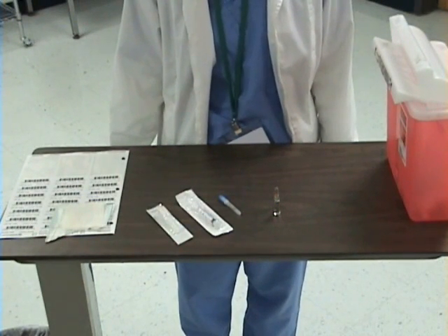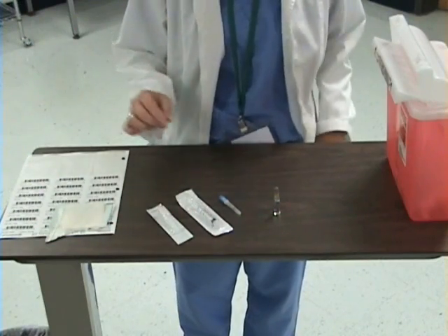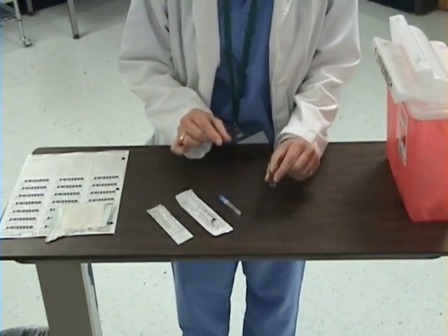This is a demonstration of how to withdraw medication from an ampoule. I will begin by gathering my supplies. First I need the ampoule — the medication that the patient is going to be receiving.